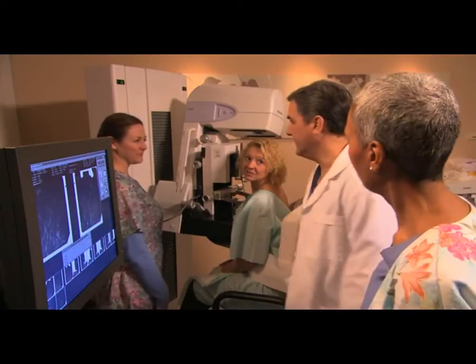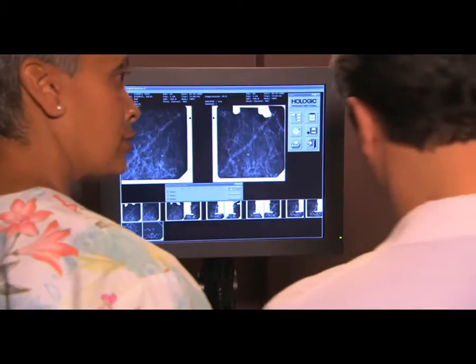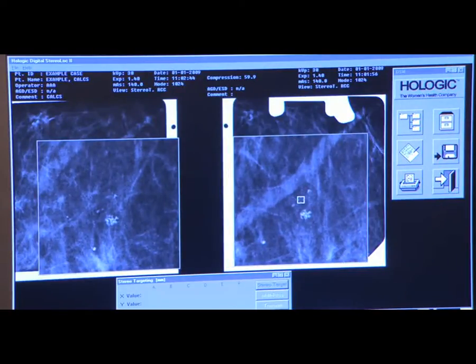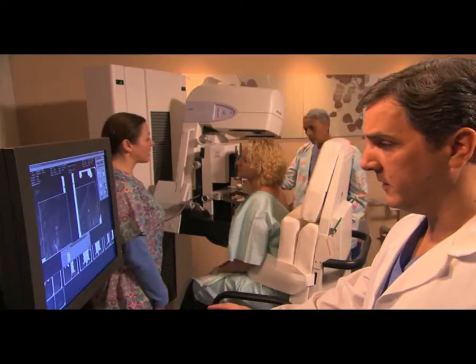Now that you're ready, your physician comes into the room. A computer is used to mark the target area on both stereo images, which gives a set of numbers to use as a guide to precisely position the biopsy device.